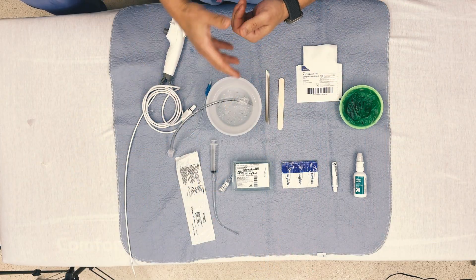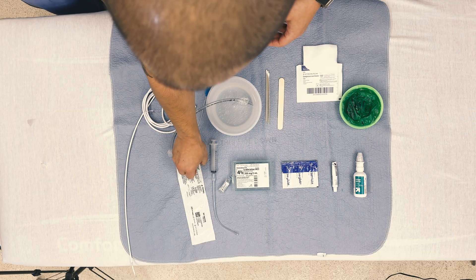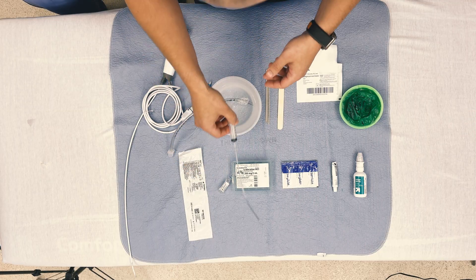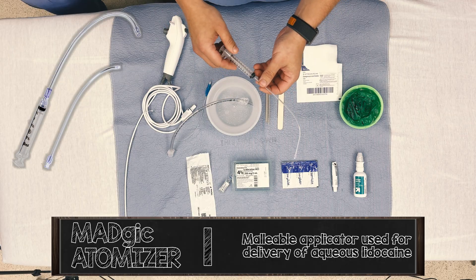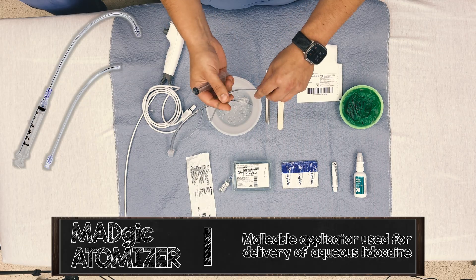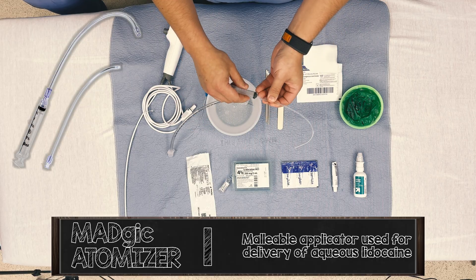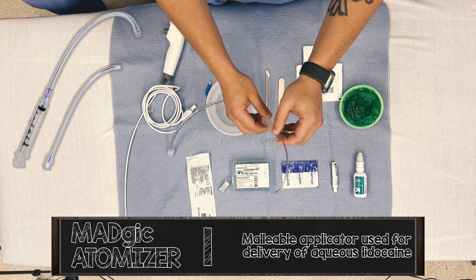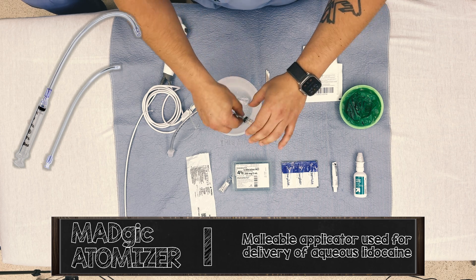Surgilube, of course, for lubricating the tube as well as the scope to get through the tube. For applying the aqueous lidocaine, we have the MADGIC atomizer — magic M-A-D-G-I-C — made by Teleflex. This is a malleable atomizer that you can form into whatever shape you need, turn the corner, and apply atomized lidocaine to the epiglottis and surrounding structures.